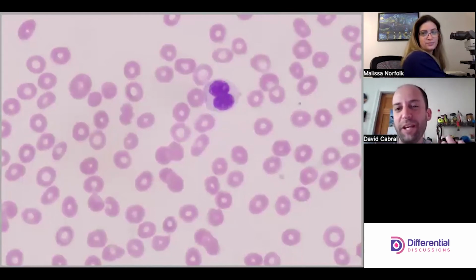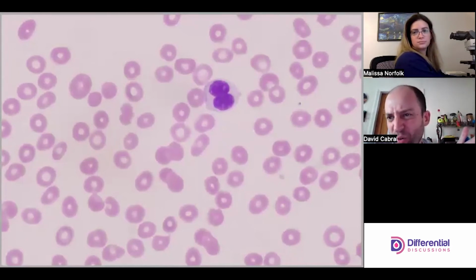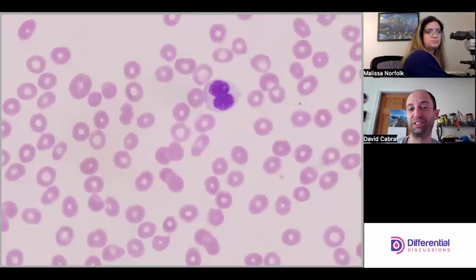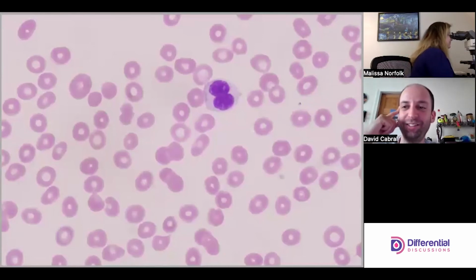So like this could be just a totally agranular neutrophil lineage, or no, like, he's a bilobed lymph. Bilo lymph. Okay, all right. Yeah, that's a lymph. I see. This is where I like the nucleus screams lymph, right? Yeah. And not uncommon for lymphs to have a pinch or like a kidney bean thing going on. This guy's got a crisis of identity, but he didn't want to be left out. Yeah, I guess he's mimicking his toxic brothers and sisters.